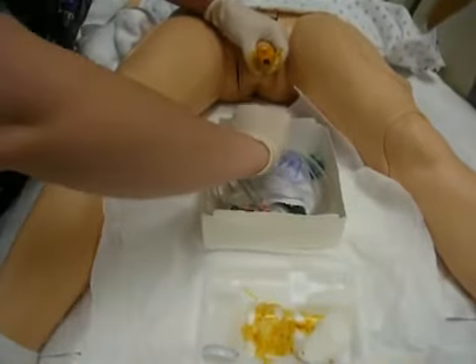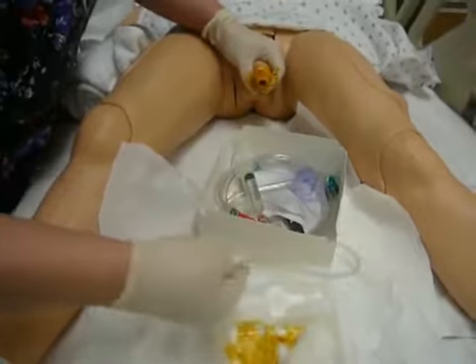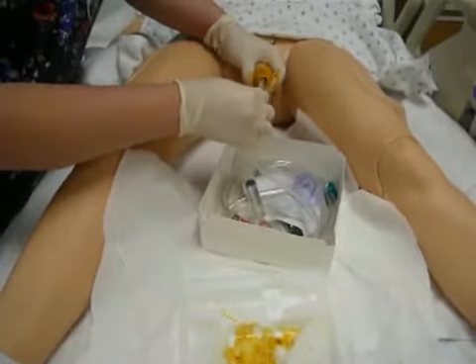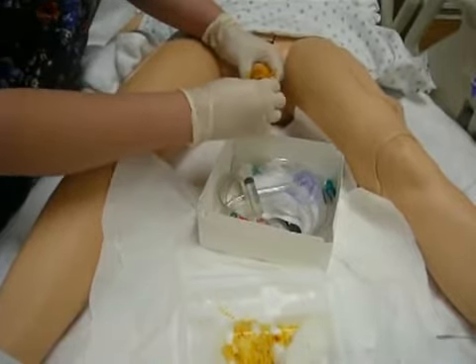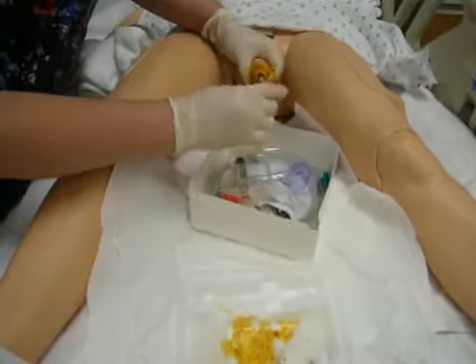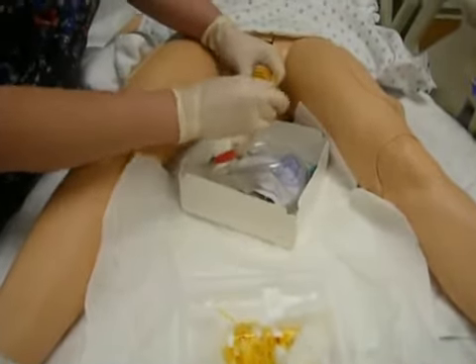Next I'm going to grab my catheter out of the box. I'm going to dip it in my lube, about 2 inches up. Make sure that I find the urethral opening. I'm going to rotate it a little bit in, making sure that I don't touch the tip of his penis with my right hand, which is still sterile, and I'm going to insert it about 6 to 7 inches. I see urine coming down my catheter.